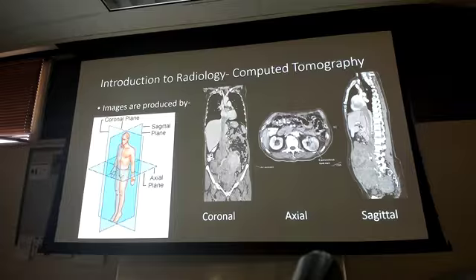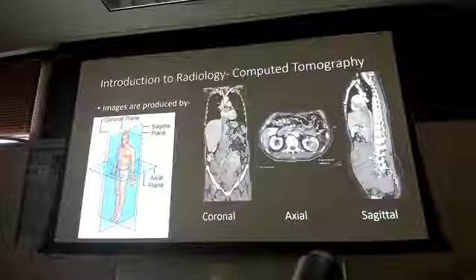And that's cutting from head to toe in slices. Just like this, all the way down. Those are your axial planes, okay? That's how the CT scanner in the middle here and the MRI scanner, that's how they get the images. One scan, axial all the way down.